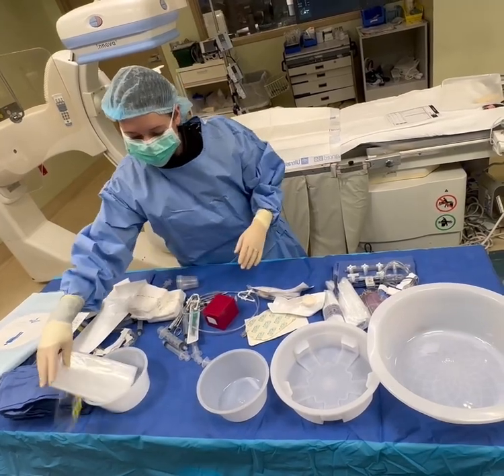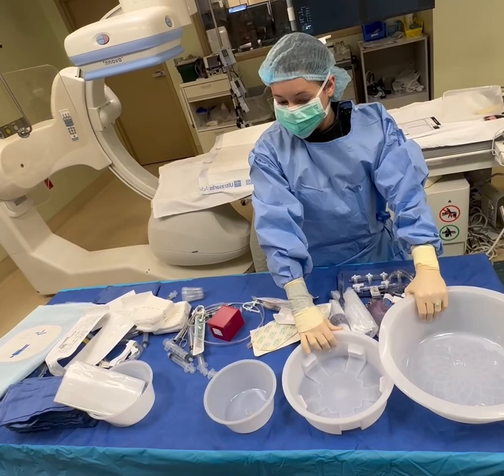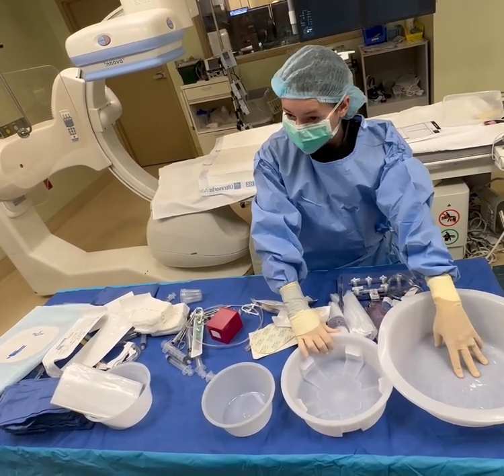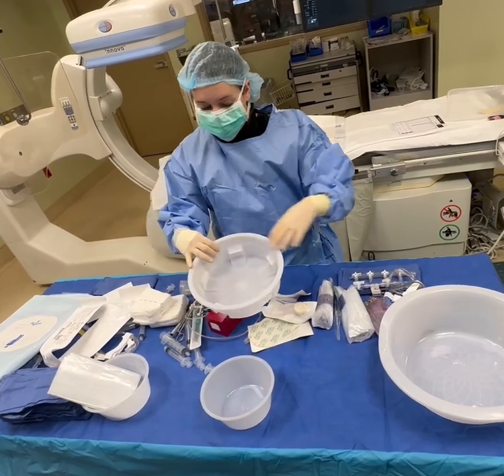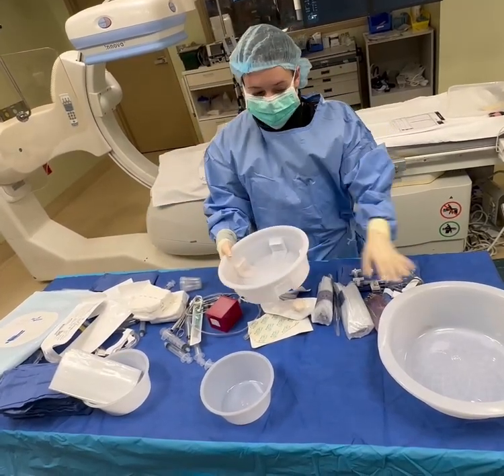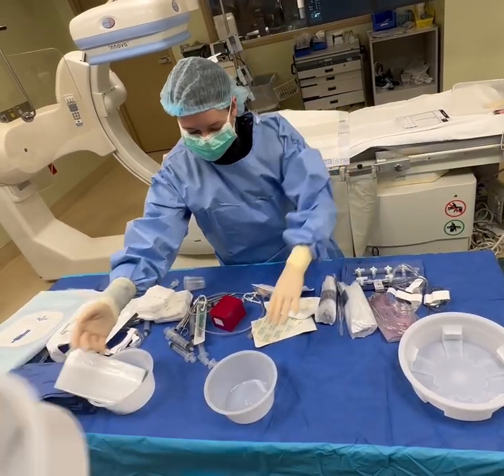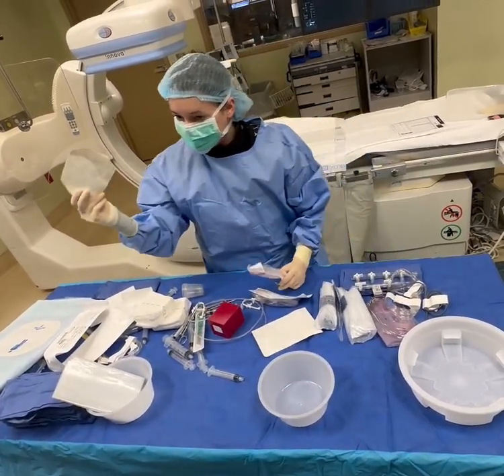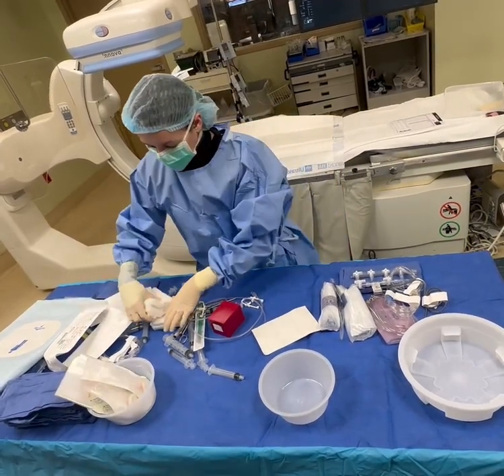So depending on your doctor's preference, and honestly your preference, which basin you would like to use, okay? Most of them prefer the bigger one, okay? But this one has the little notches to help you for wire control, all right? So for time's sake, in your room, we're going to get rid of this one, and we're going to keep this one, okay? So I'm going to take this off. It's all about preference. Tegaderm comes in the pack for after the procedure. Chloraprep, I'm going to go ahead and put them out of my way.